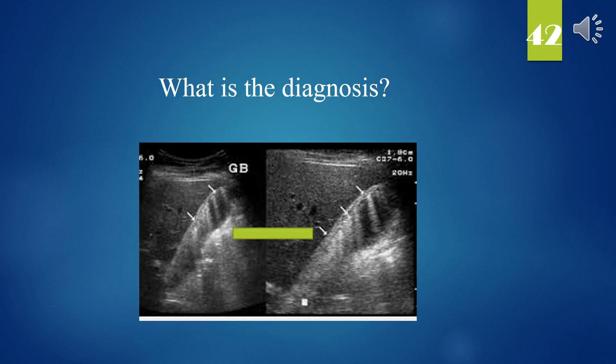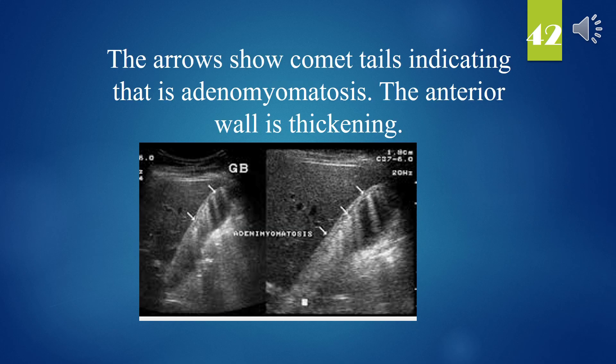What is the diagnosis? The arrows show comet tails indicating adenomyomatosis. The anterior wall is thickening.